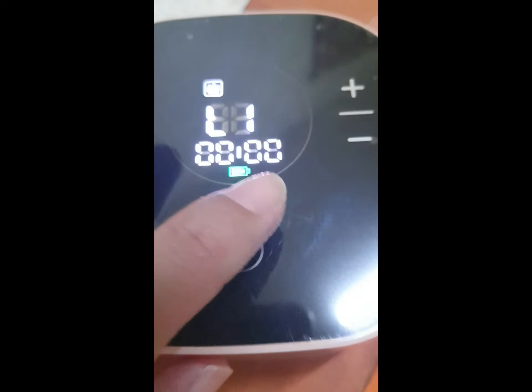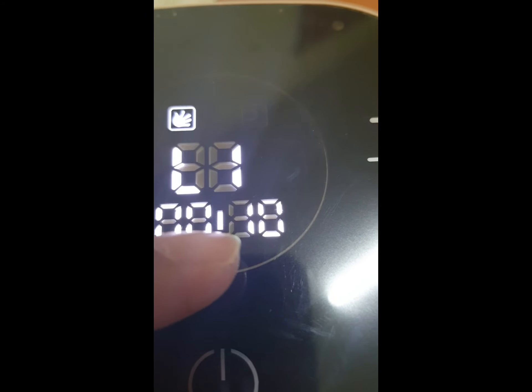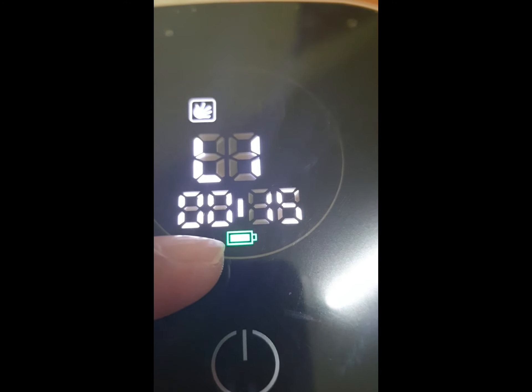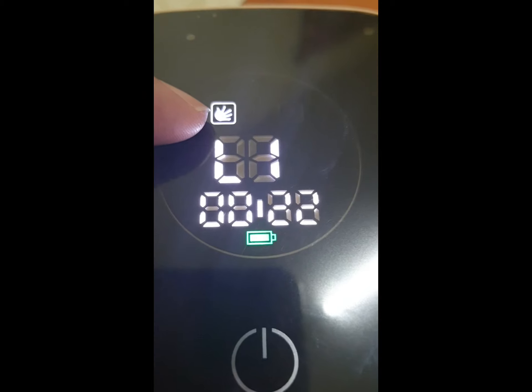Okay, let's turn on the motor. This is the level indicator — level one. This is the time indicator: 9, 10, 11 seconds. This is the battery indicator — it is still full and shows color green. When it's low, it turns color red.